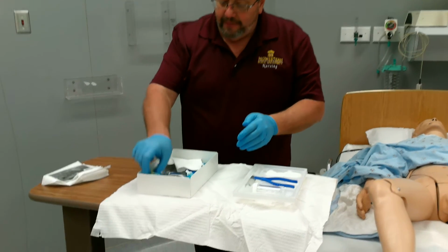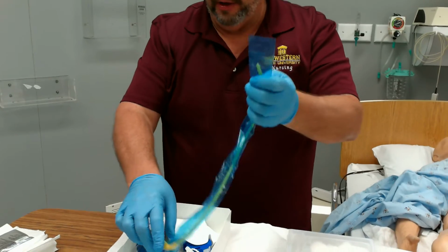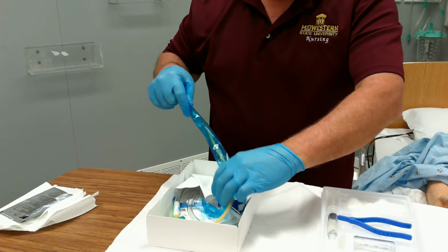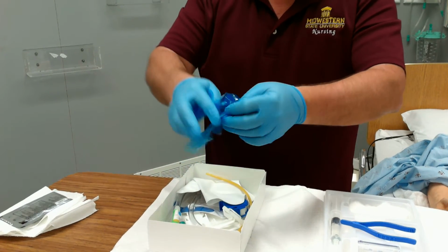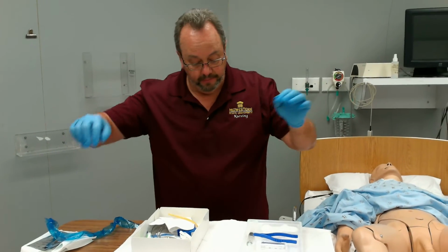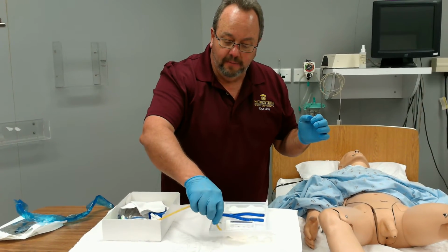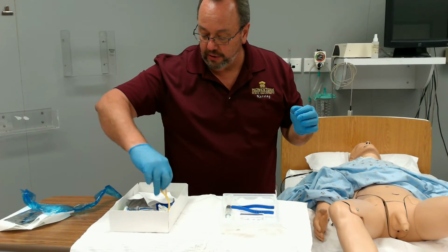So here I've got a sheath, a blue protector on this. What we want you to do with this is take this off, and keeping that sterile and in that box, slide that off, making sure your tube does not contaminate anything. Take this and throw it away. Now where I put that gel, I'm going to lubricate the tip of my catheter. A good 2 to 3 inches on that. Some good lubrication on there.